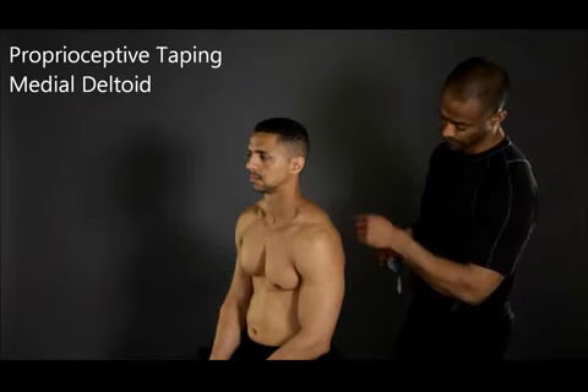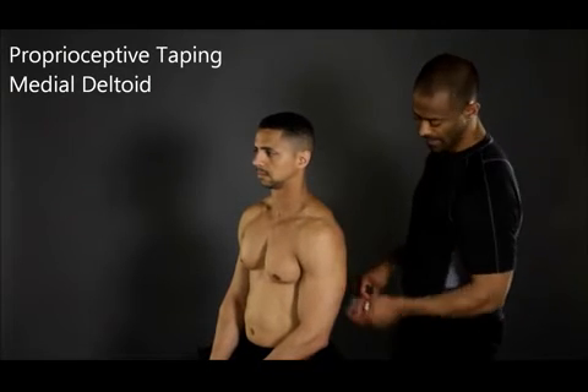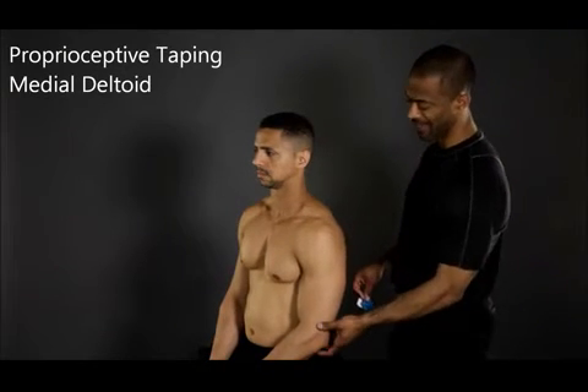In order to tape the medial deltoid, instruct your client to sit with their spine in neutral and have them abduct their shoulder to 90 degrees.